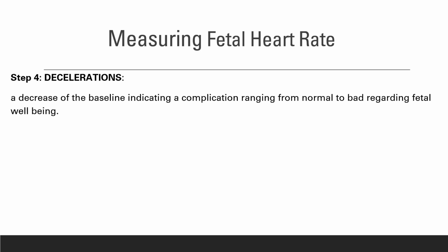First and foremost, you want to establish the baseline. Just like adults, we all have different baselines. Same with the fetus. Usually, early in their gestation, they're more tachycardic. As they become term, they start to normalize in the 110s. And again, every baby has a different baseline. So first and foremost, you want to be able to establish your baseline.